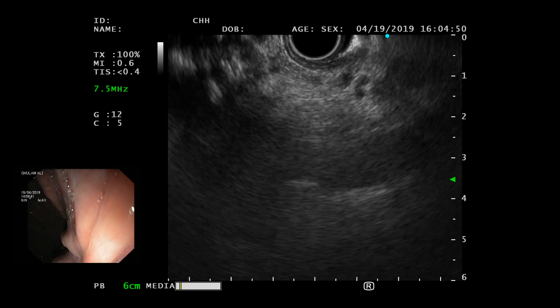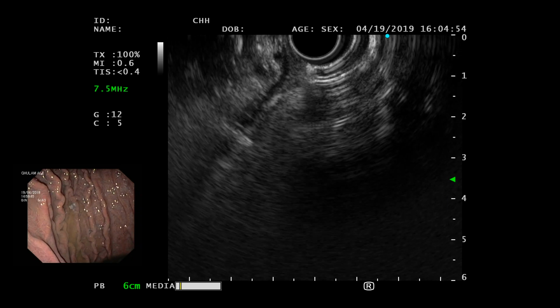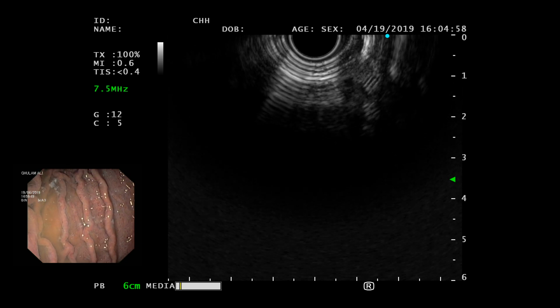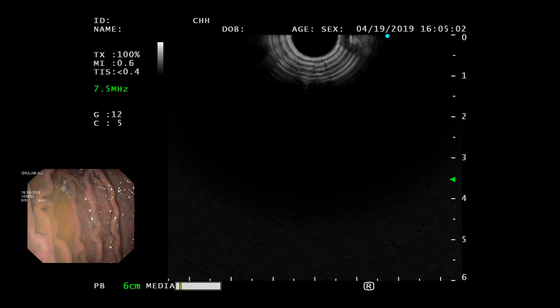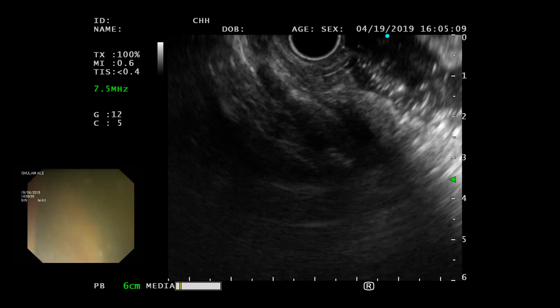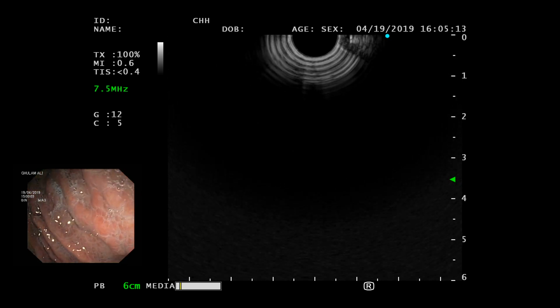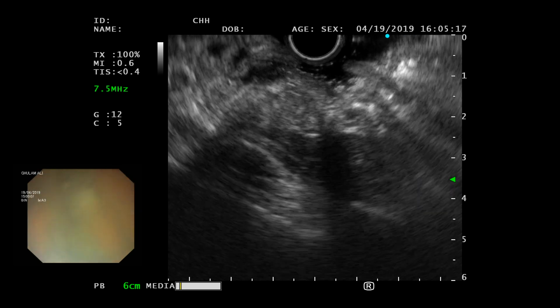Now move the wheels downward, you see that? Okay, stop there. Now go towards that. Just go straight. Okay. Go straight. Now stop here, suction and big wheel towards you. Suction and big wheel towards you. Yeah. No, keep going, you should keep suctioning. Keep doing suction, okay. Suction, keep suctioning. Yeah. Okay.